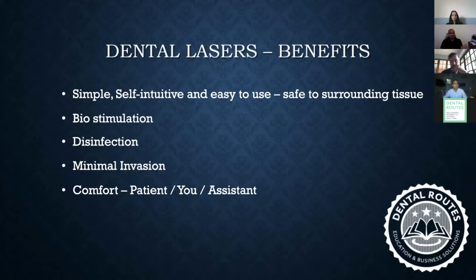And the first three things are what make it minimally invasive as well. Because if you remember the slide I just showed you, you can not only target a particular site, you can also target a particular structure. You can target just the blood, or just the hard tissue, or only the soft tissue without targeting the hard tissue. That way, with the same tip, you are able to keep your surgery and treatment protocols extremely minimally invasive. And with those 4 points, I don't have to say how comfortable it is going to be for patients, you, and the assistant.